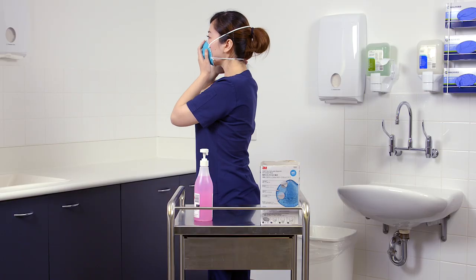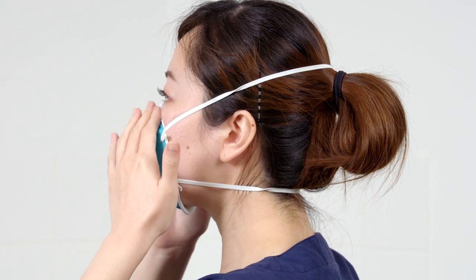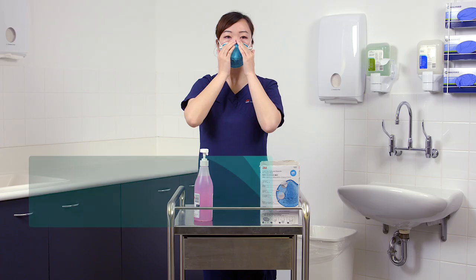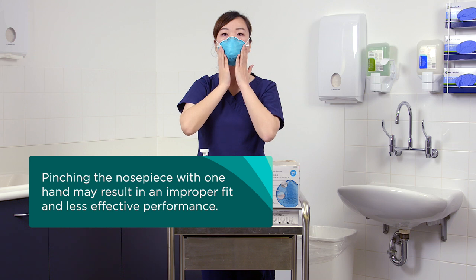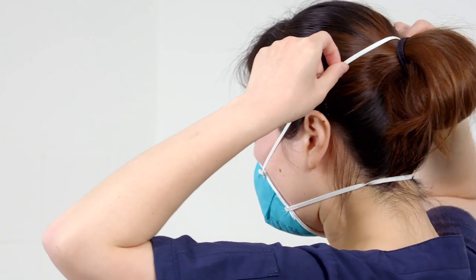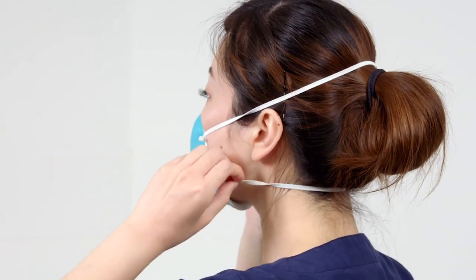Using both hands, mould the nose clip to the shape of the nose bridge by pushing inwards while moving your fingertips down both sides of the nose piece. Always use two hands when moulding the nose piece. Pinching with one hand may result in improper fit and less effective respirator performance. Make sure that hair, facial hair, jewellery and clothing are not between your face and the respirator as they will interfere with the fit.